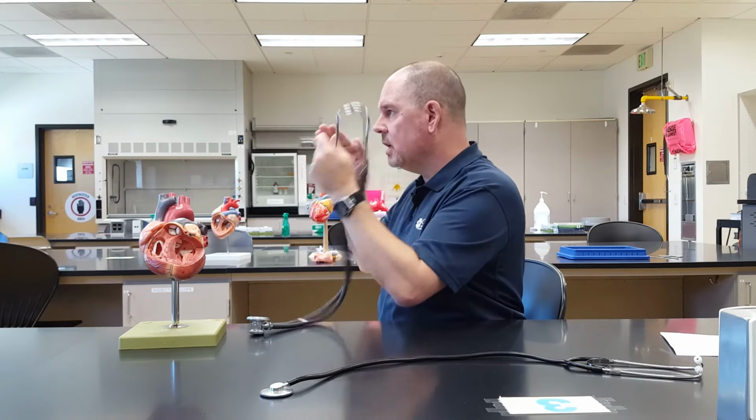So I line it up with my nose so it makes a peak just like my nose does, and then I put these two things in my ear canals. And then, of course, I can just drape it off my neck and walk around and be all clinically cool, like some of you people will be. Maybe if I was wearing scrubs, it'd even be better. I'm just cool medico, like that. But that's how you wear it.